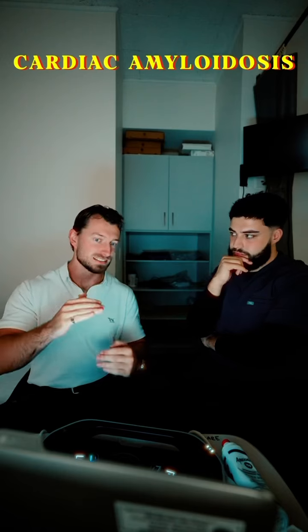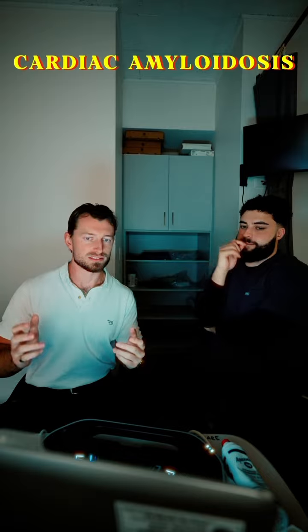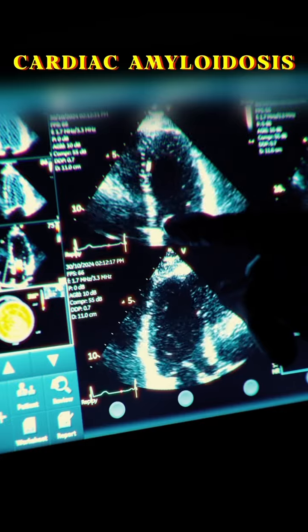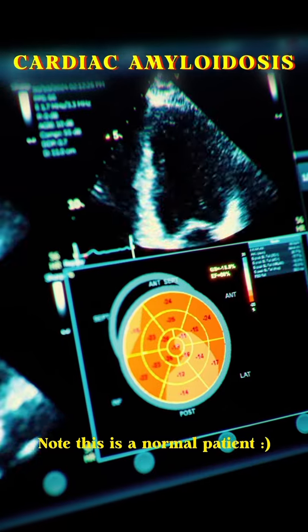So today's discussion ended up being about cardiac amyloidosis, which is an infiltrative condition where we have proteins building up in the heart muscle, and this can sometimes affect our overall cardiac function. Ari was explaining that cardiac amyloid has this distinct rosebud pattern that we'll see on our GLS, which shows us a reduced function with apical sparing specifically.